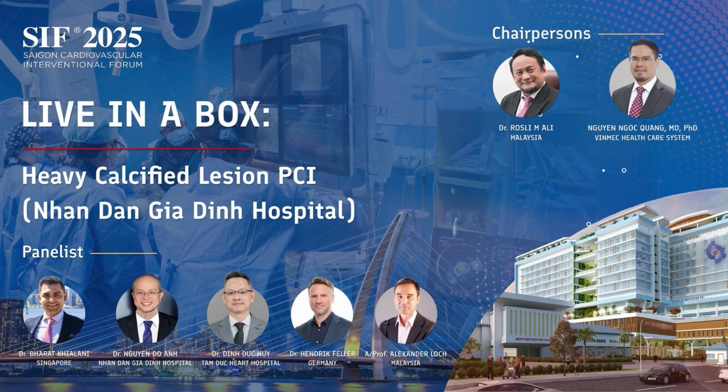And the second one is a lot of different opinion. But I can see here, IVL is the first option and the second option is rota first and then see what is going on. Because in this situation, you might end up with a lot of IVL and then the cost increases. So now we ask again and see how the people from Nhan Dan Gia Dinh hospital would do.